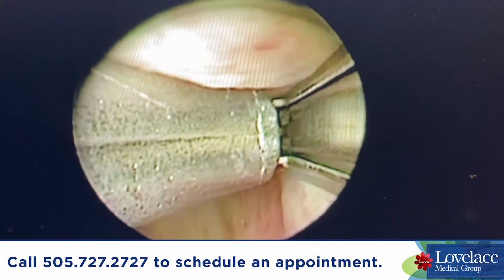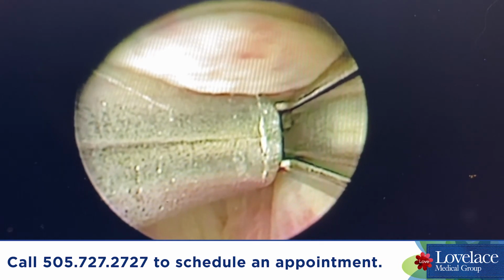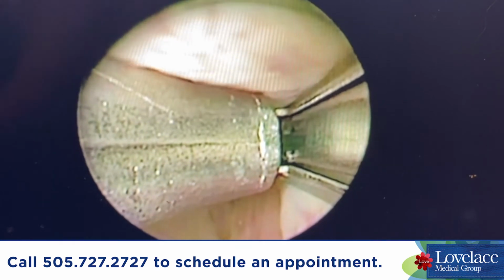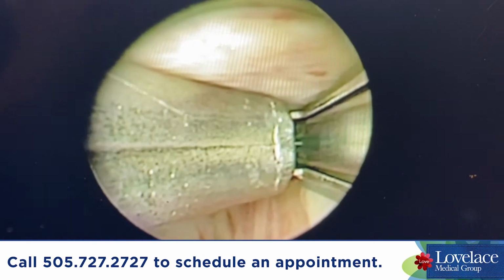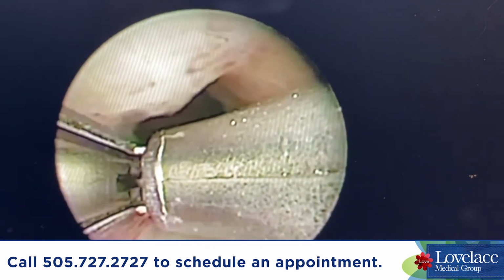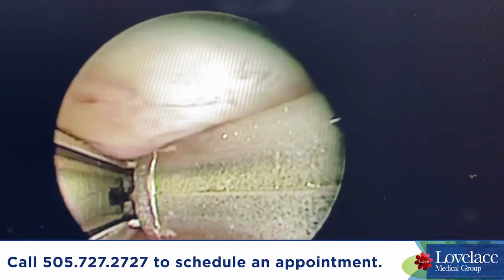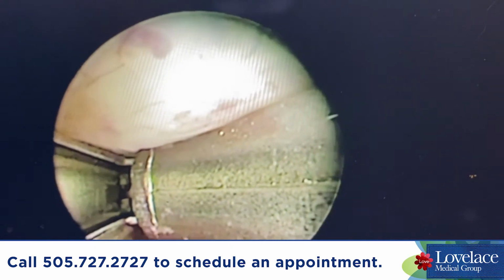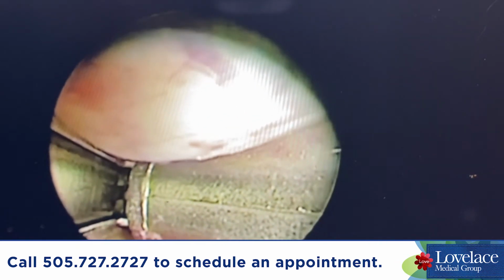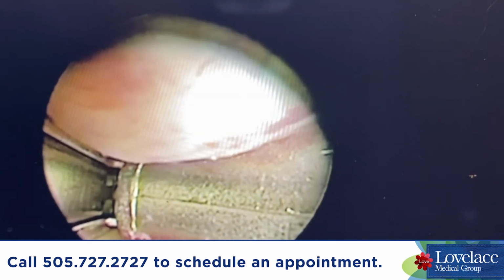This metal thing running horizontally across the screen is the Urolift deployment device. What we're doing is deploying a surgical clip into the lateral sides of the prostate. As each clip is placed, it tenses the urethra laterally and out. You can see, on the right side of the prostate, the clip is going to be placed and it's deployed right there.